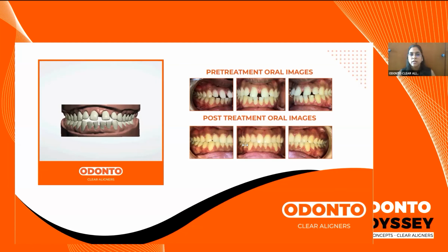I would suggest that you don't just rely on the burr. Say I have run a burr of 0.3 mm between two teeth and the burr is going smoothly, so that's the end of it and I don't need to do anything further.